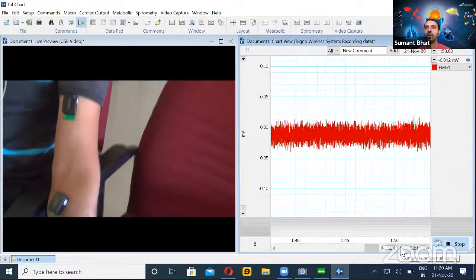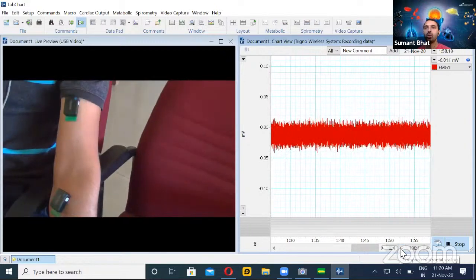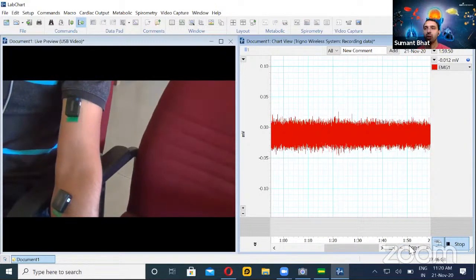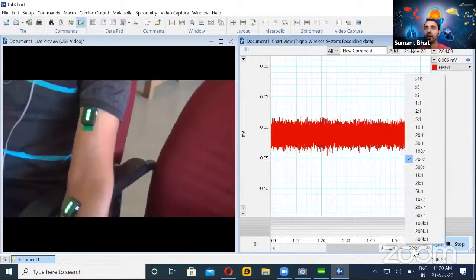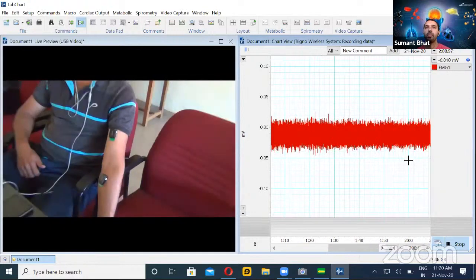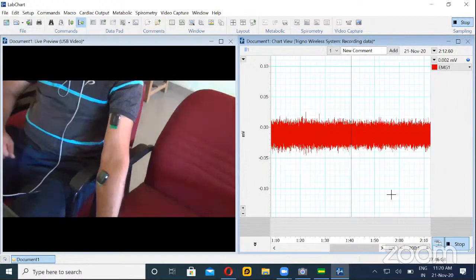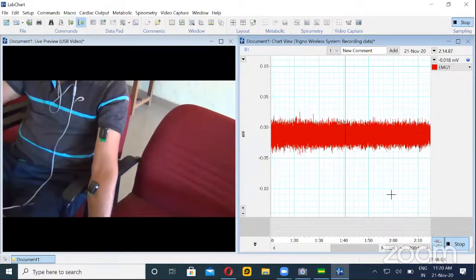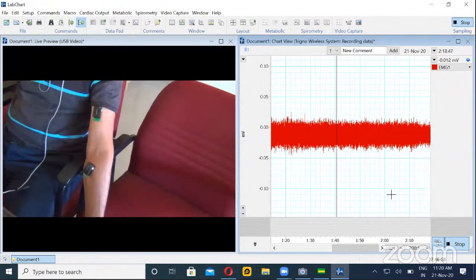I can use these tools or icons to compress and expand the data. The moment you take the cursor onto a particular icon, it shows what the function is. I'm just compressing so that I can see a larger timeframe. Alternatively, you can also click on the ratio, say 200 to one, and jump to whichever ratio you desire. Just follow where the cursor is going.